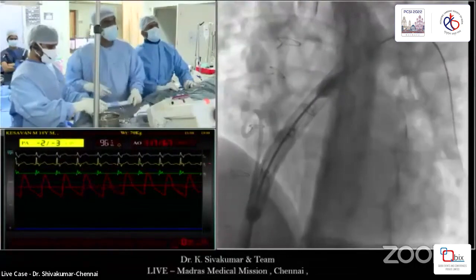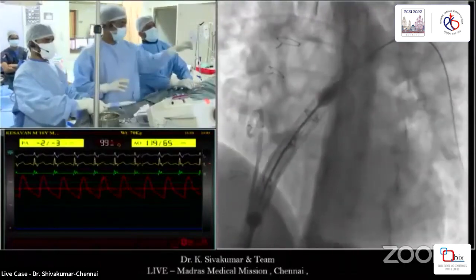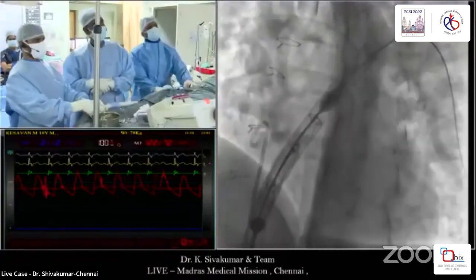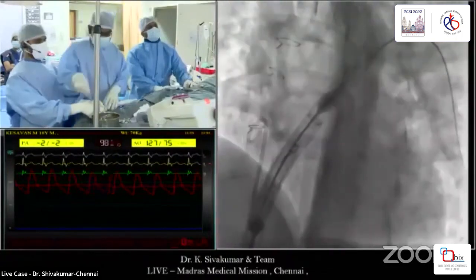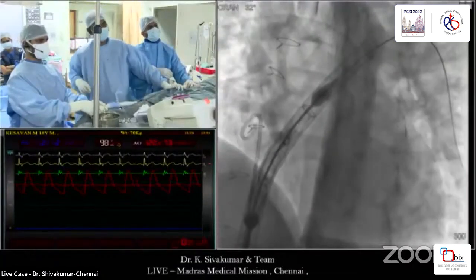If part of the distal flare jumps down, it's really uncontrolled. So for this, I would have gone for the RPA, and then you've got a bit more control in pulling back. I think I agree with you, Shaq, probably because this was falling back.